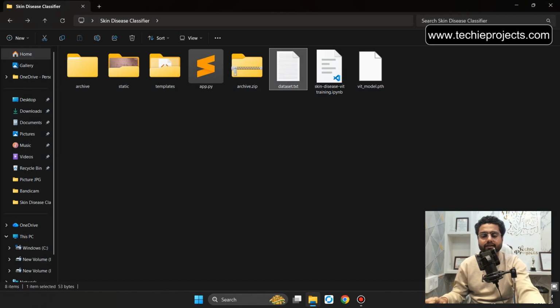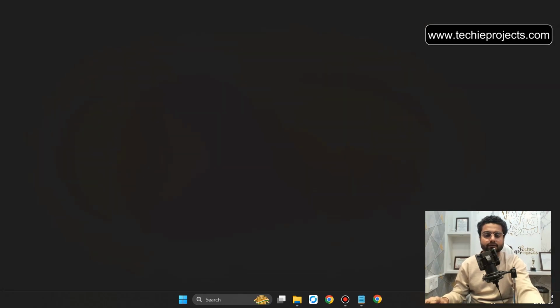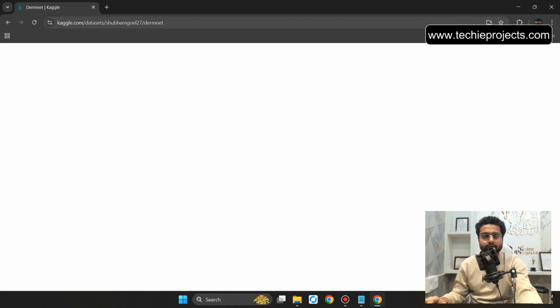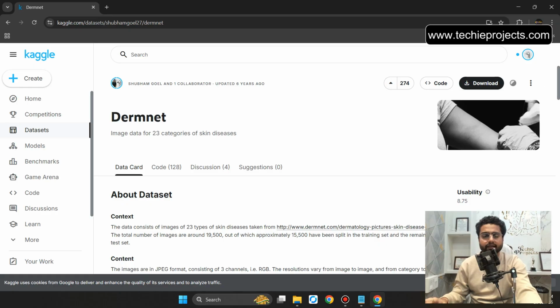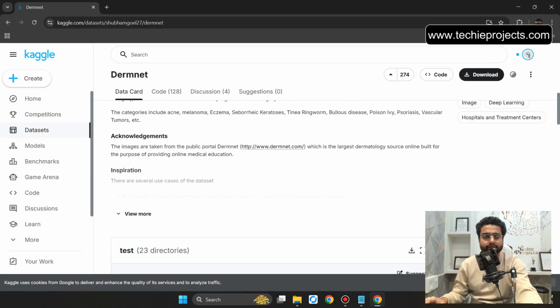And this will be the dataset link. Let's open that particular link, copy that link and paste in browser. Let's paste here and enter. So it will open the dataset link. You can check that data consists of images of 23 types of skin disease taken from that particular link, and total number of images are around 19,500, out of which approximately 15,500 have been split in the training set and the remaining in the test set.